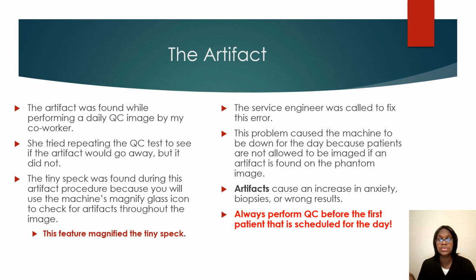That's why you have to do your QC properly, making sure that you are checking for mistakes like this, because you can help avoid someone from getting called back, someone from getting surgery or incorrect results.